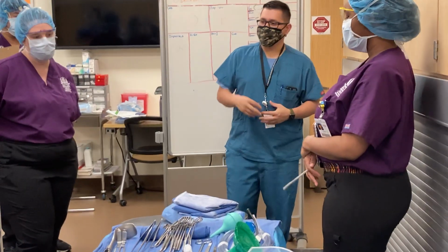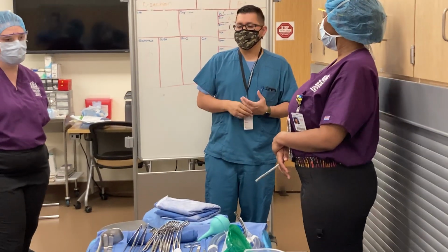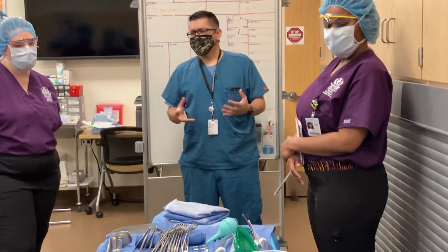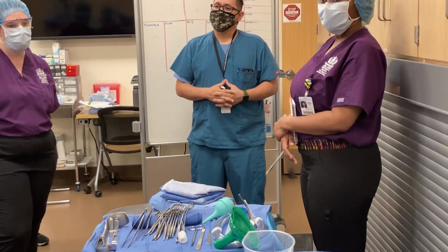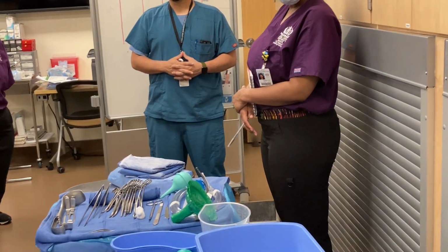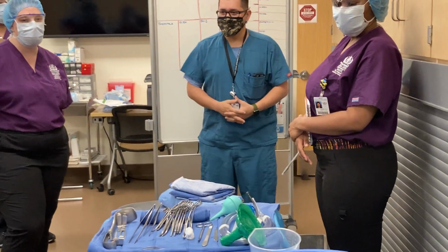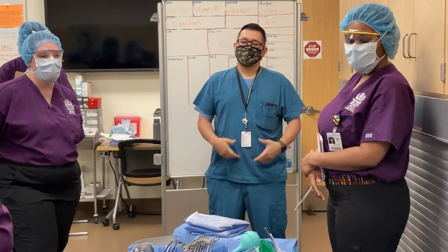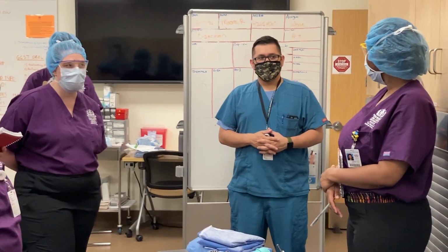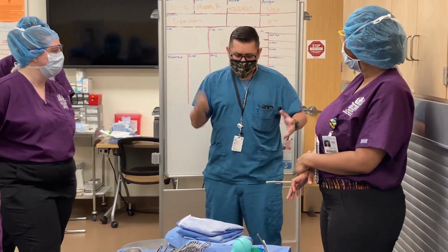But yeah, literally we go there and test to see if you can actually feel. What instrument do you think you could use here to start feeling? Yes. Alice? An Alice? That's kind of aggressive. Babcock? Okay, Babcock's kind of aggressive. We haven't even started surgery, guys. We're just checking to see if the patient feels it.